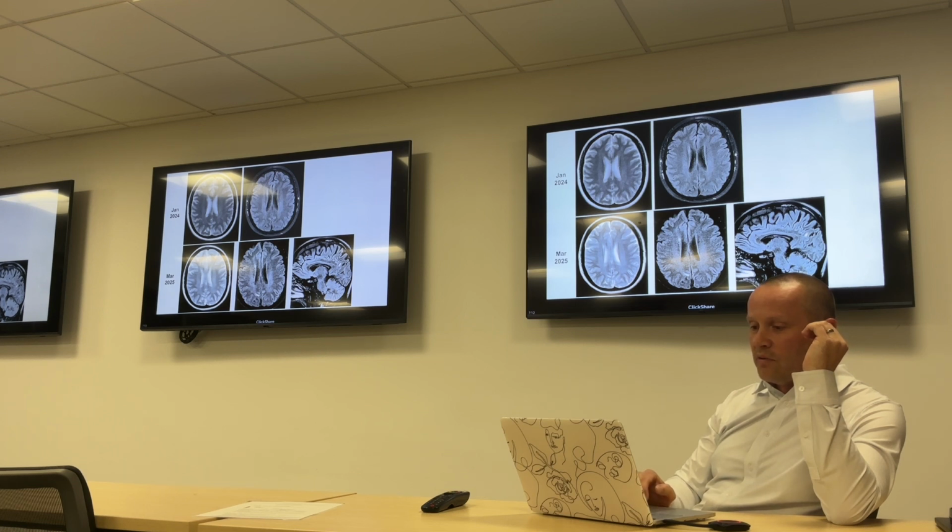This is that lesion that I mentioned a second ago that's unchanged. It's been there a long time. It's not any different. But what you can see pretty clearly is that there's this new little blotch. This is in the subcortical white matter of the parietal lobe. And if you look closely, you can actually see it here on the T2 picture as well, right?